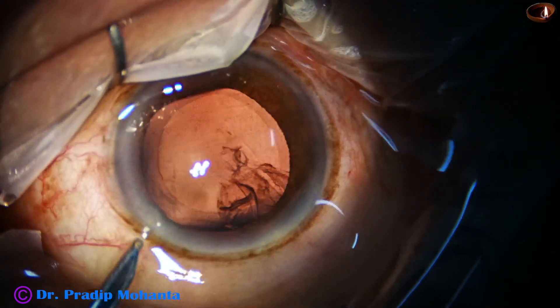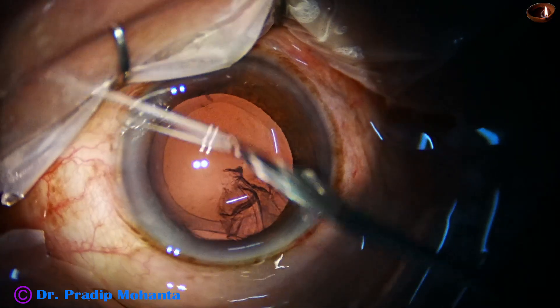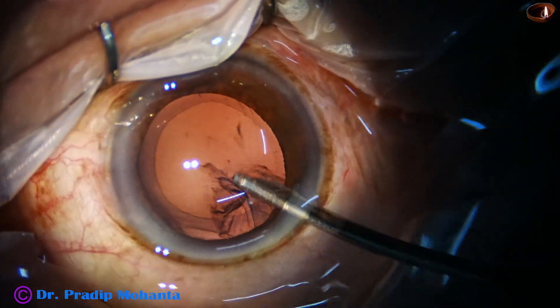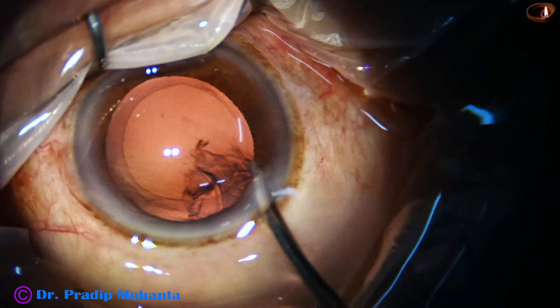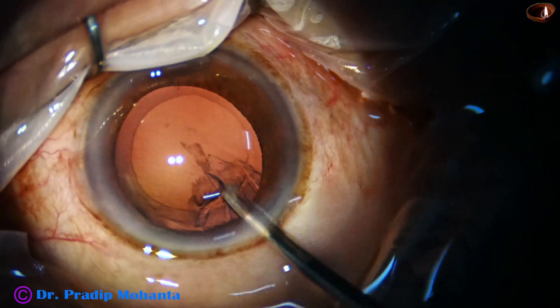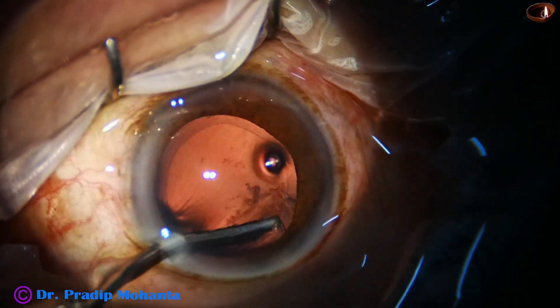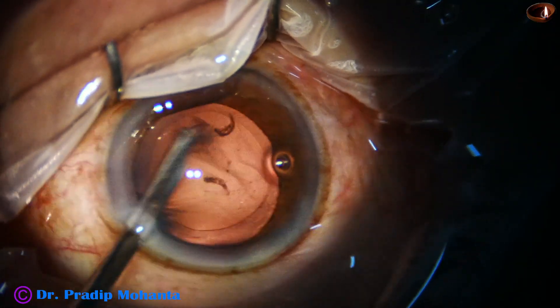Yes. The sub-incisional cortex — there is a small bit of epinucleus. We have to remove that first. Yes, it has come out this time. And now the sub-incisional cortex is removed.